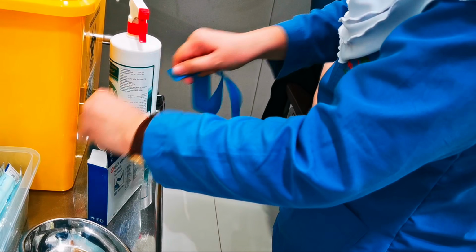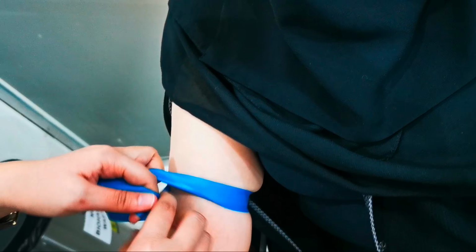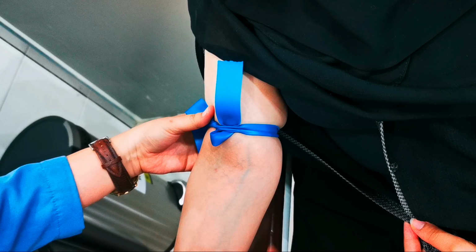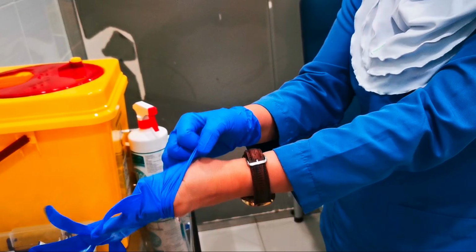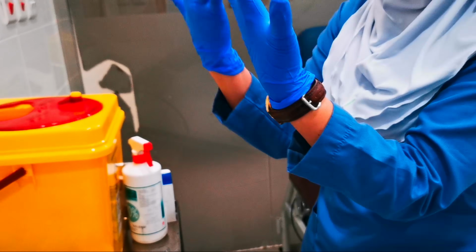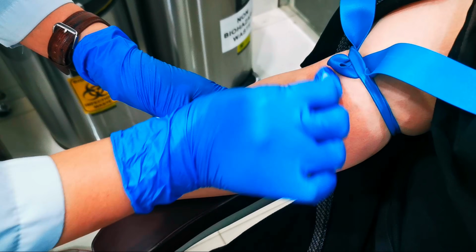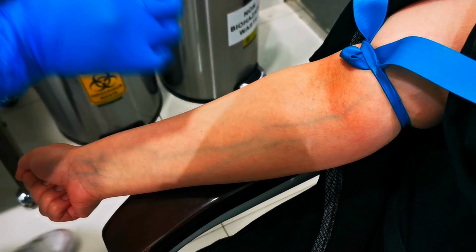So, apply the tourniquet on the desired arm. Yan. Dapat 2 inches above the desired location. After nating matalo yung tourniquet, it's our time to wear our gloves. Now is the time to do the aseptic technique. So we will clean the site from the inner to the outer part.